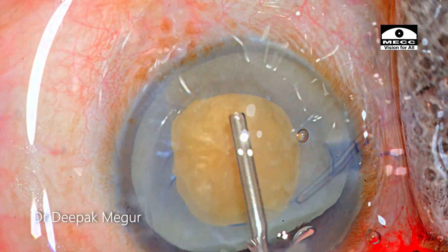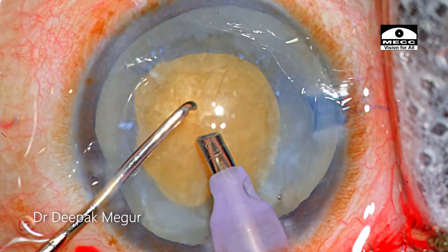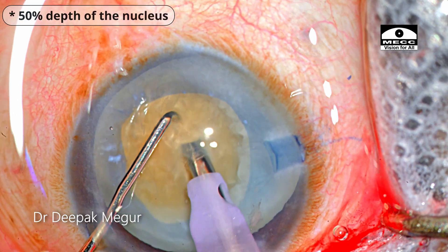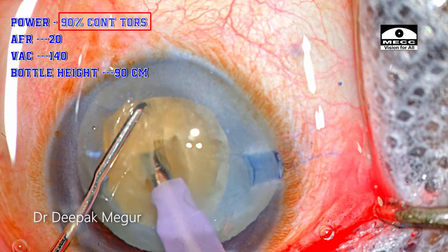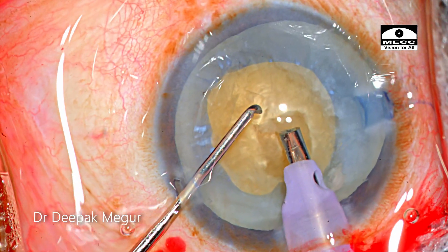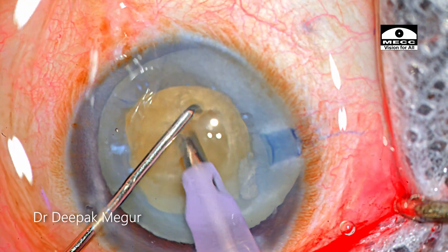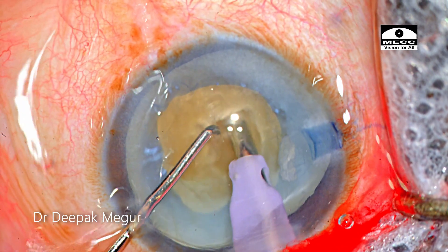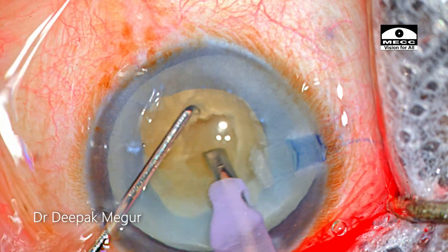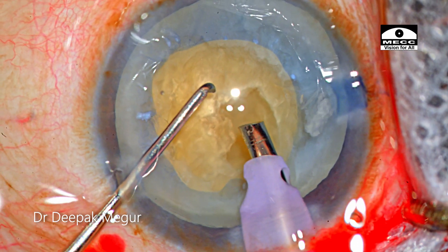As is my typical strategy, which you must have noted in my previous videos, I make a small central groove of around 50% depth in this patient using continuous torsional energy. The idea is to bury my phaco tip as deep as possible. Since the phaco tips of the Alcon machines are extremely thin, we don't get enough purchase for burying. So it's important to hold the nucleus in its central core and as deep as possible — that's the trick to get the perfect grip.